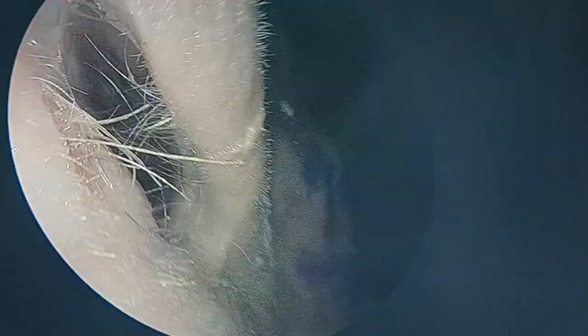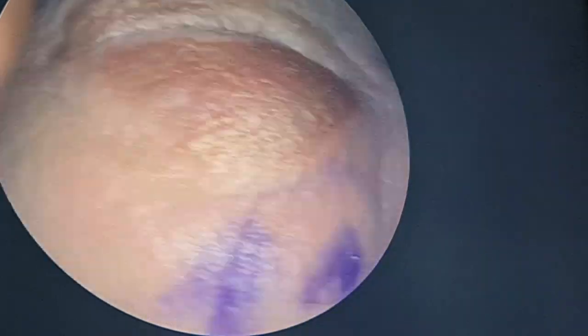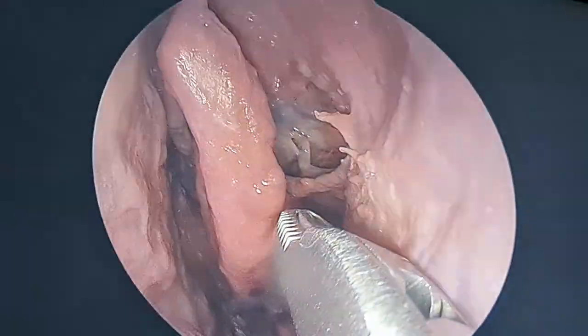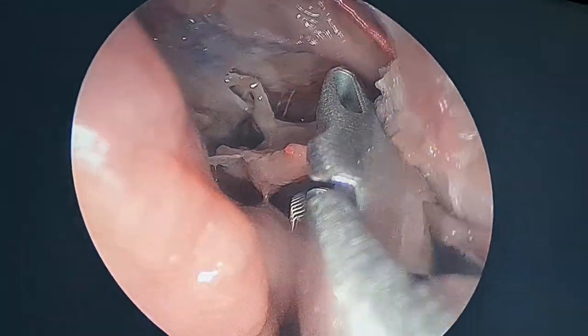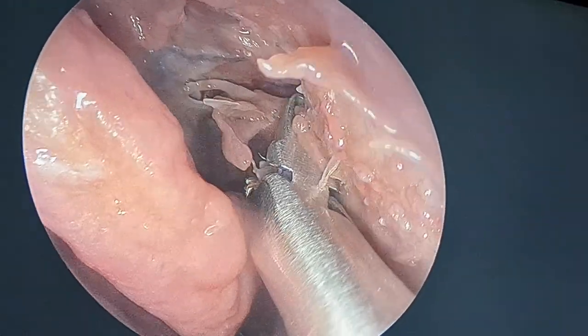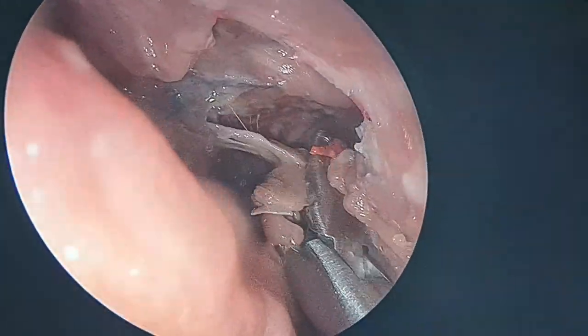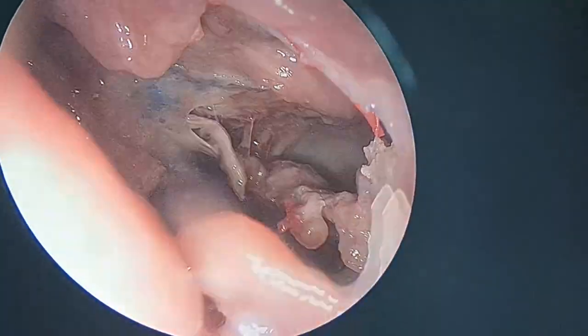So that is the first opening of the sinus through biting or scissors. Take through biting or scissors, anything, or a straight shaver. So this is my favorite tool, the through-biting forceps. You can use it, this is a fantastic tool. See, in sinus surgery there is a lot of role of sharp instruments.